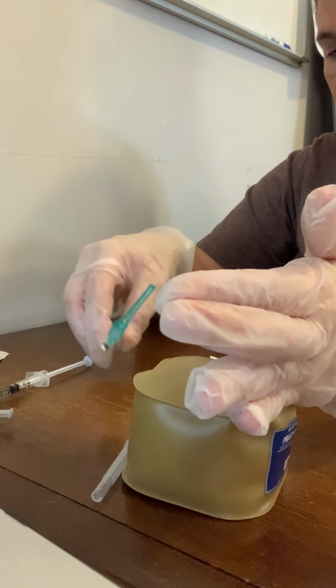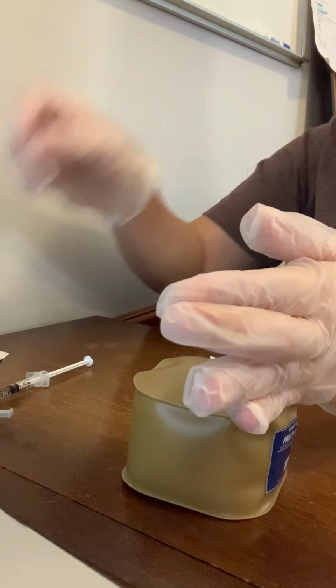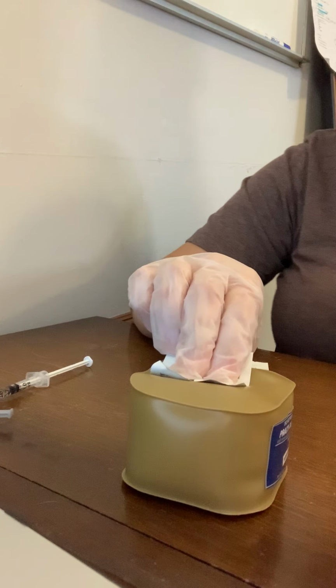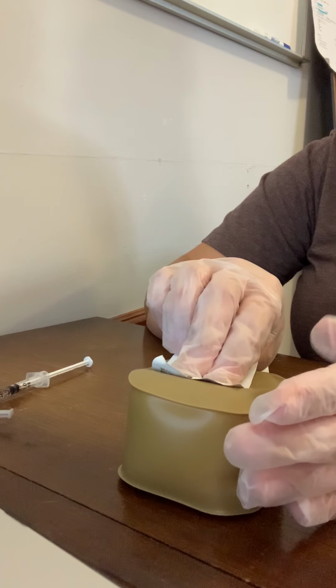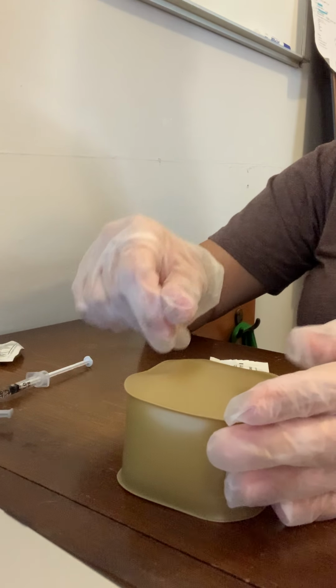I'll remove my needle and discard it into the sharps container and grab a gauze, apply gentle pressure. All right, and put a Band-Aid over the site.